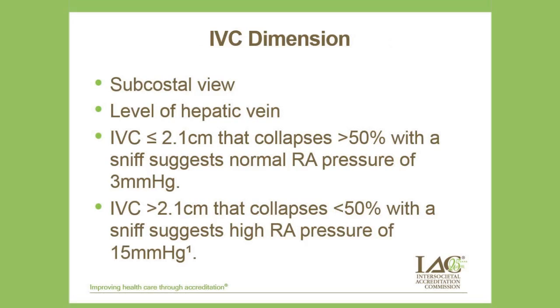Okay, so next we'll look at measuring the inferior vena cava. Of course, we'll do this from a subcostal view. Remember that we do encounter patients where we can't image the subcostal view all the time, from epigastric gas or whatever they may have living in that area that causes us to obscure the area around the IVC. So at times we may have to alter this view. We may have to go around on their rib cage laterally and project in through the liver that way to see the IVC.